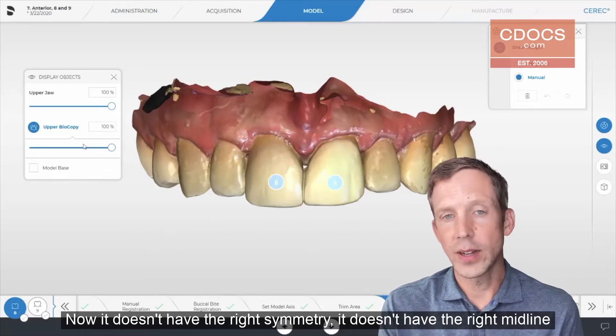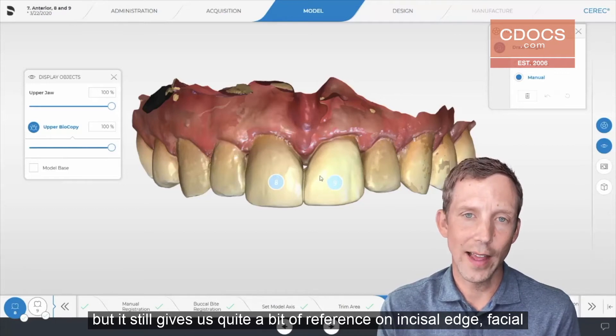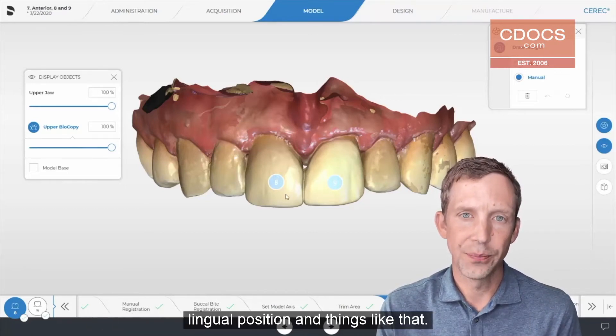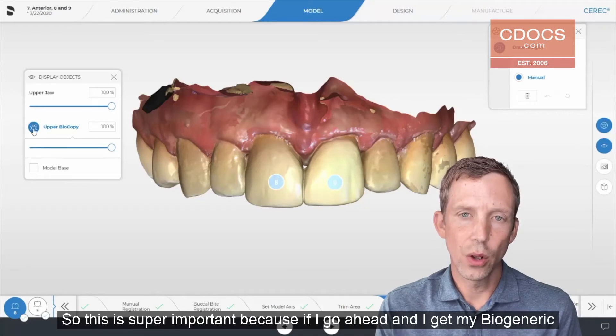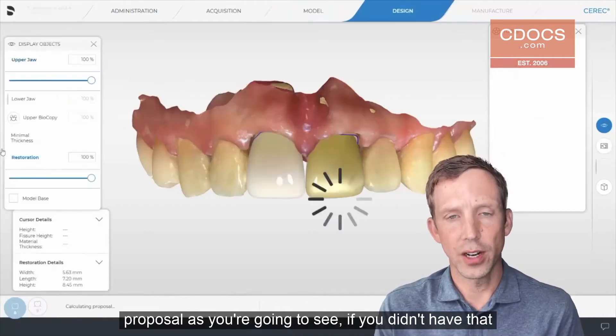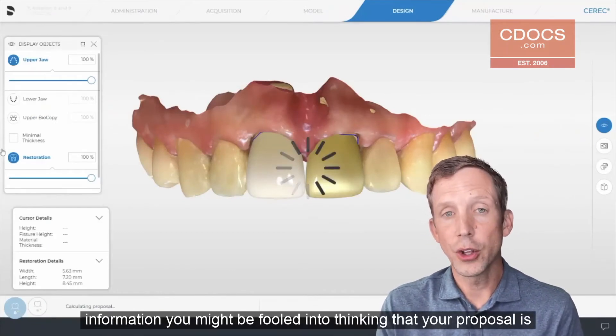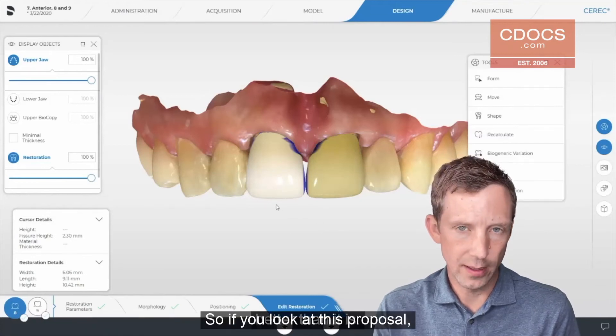It doesn't have the right symmetry, it doesn't have the right midline, but it still gives us quite a bit of reference on incisal edge, facial-lingual position, and things like that. This is super important because if you get your biogeneric proposal without that information, you might be fooled into thinking that your proposal is better than it is.